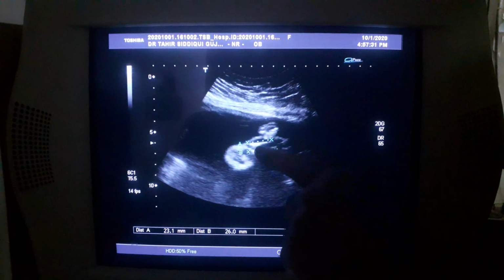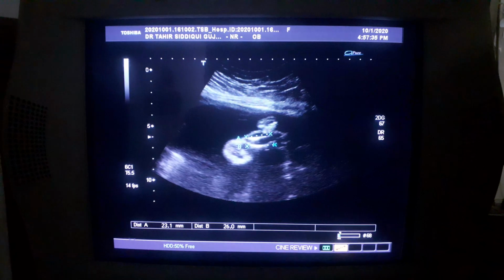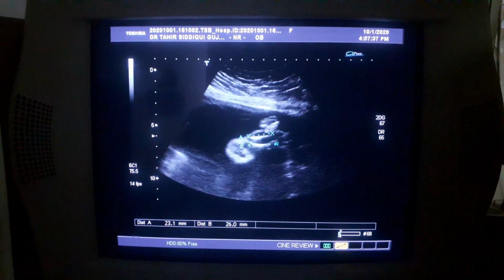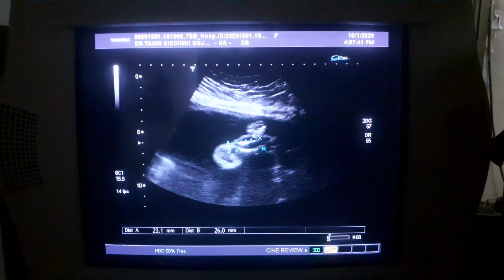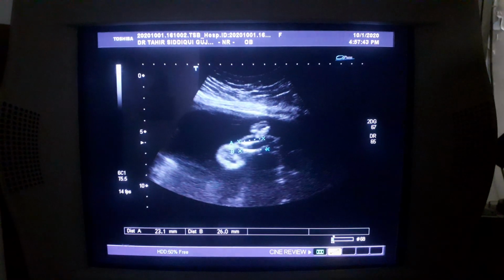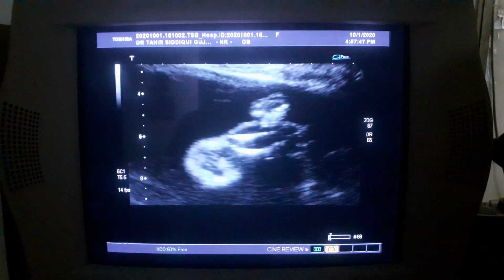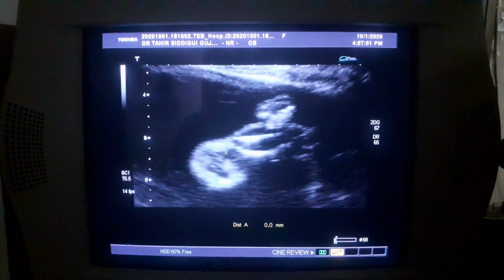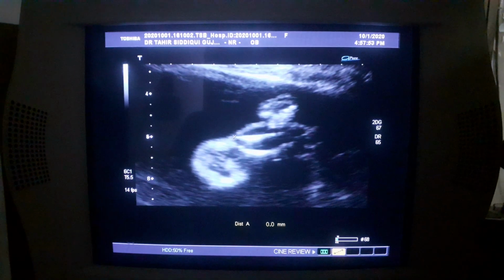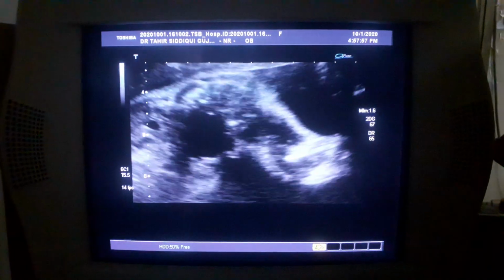So this is much below the normal measurement, should be at 97 percentile, should be something above 28. And you see, also note the bowing of the bones. You see, the bowing of the bone is seen. So this was tibia and fibula.